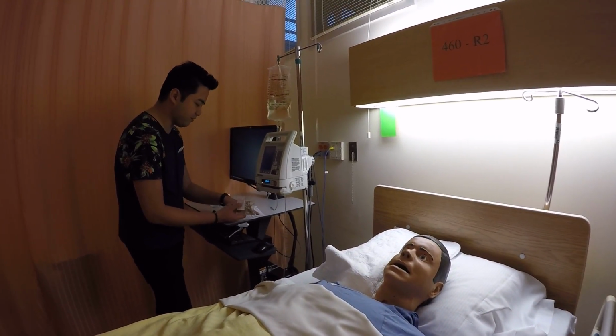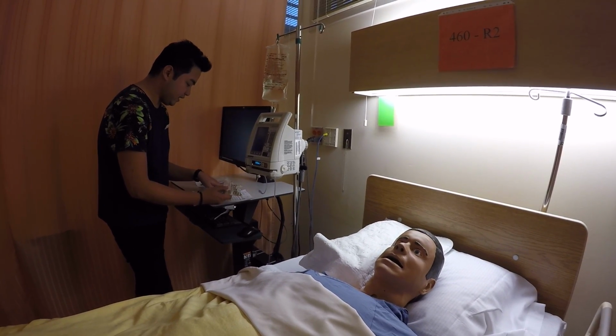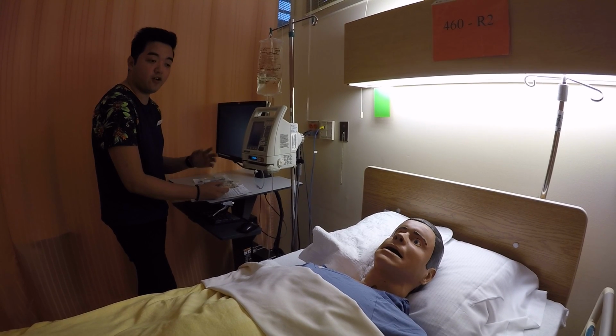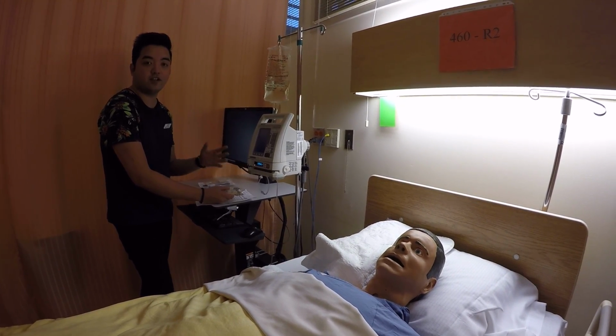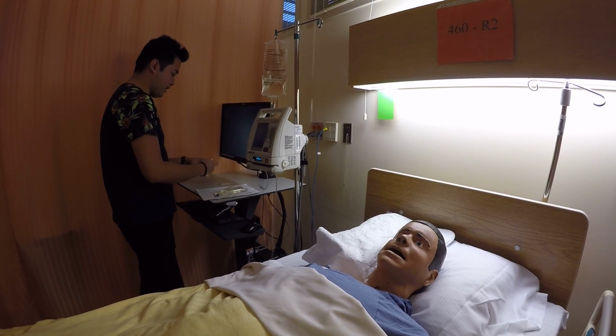Okay, just make sure for the patient, Mrs. De La Cruz, and then cefoxitin, 1,500 milligram IV. The time is now, every 8 hours. And then also, I forgot to mention that at any moment of time, if the patient says no, did not agree on receiving the medication, he has the right to do so. Okay, so now I'm ready.